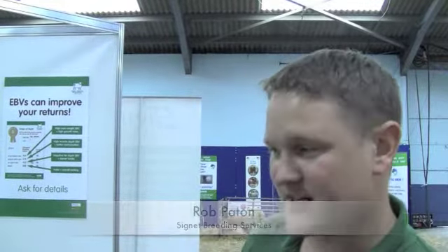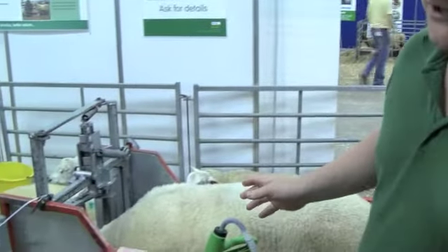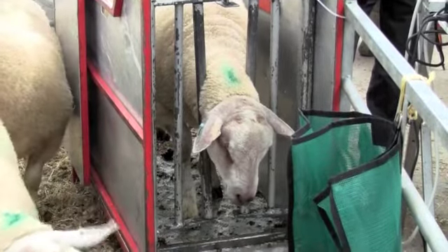We're on the Signet Breeding Services stand here measuring fat and muscle depth on the loin area of lambs. That information is used to make up the estimated breeding values for pedigree sheep, and we do this on cattle as well.